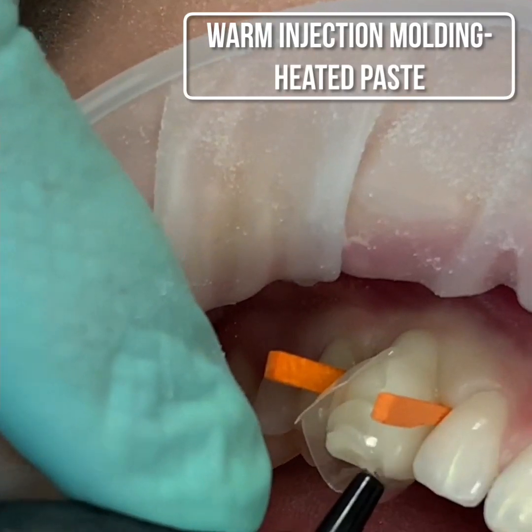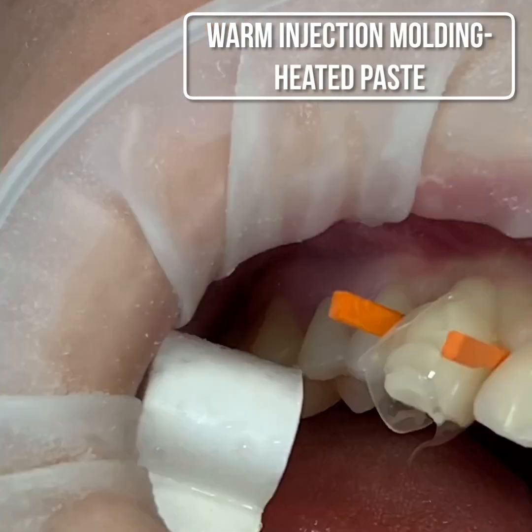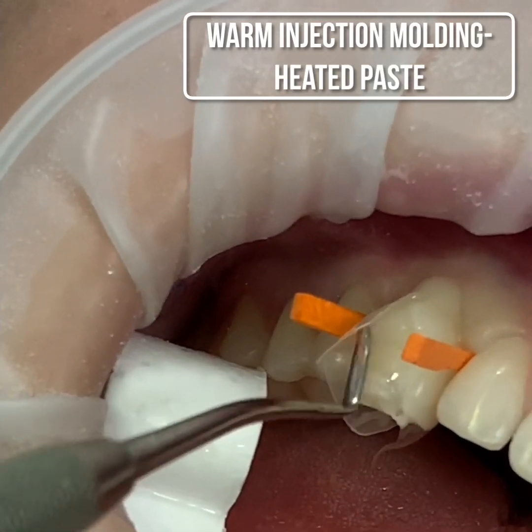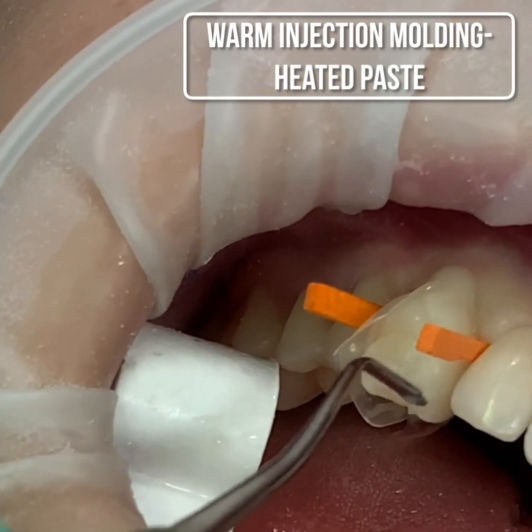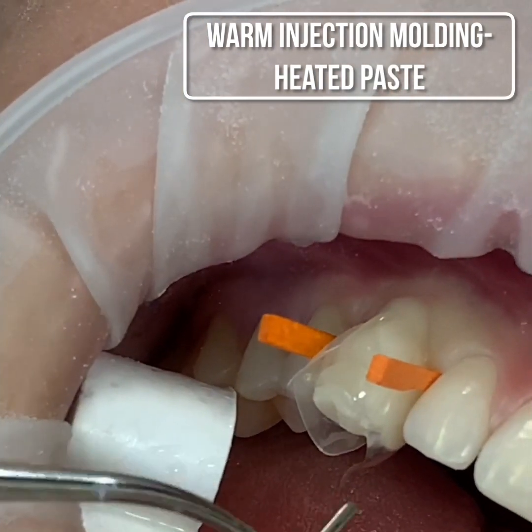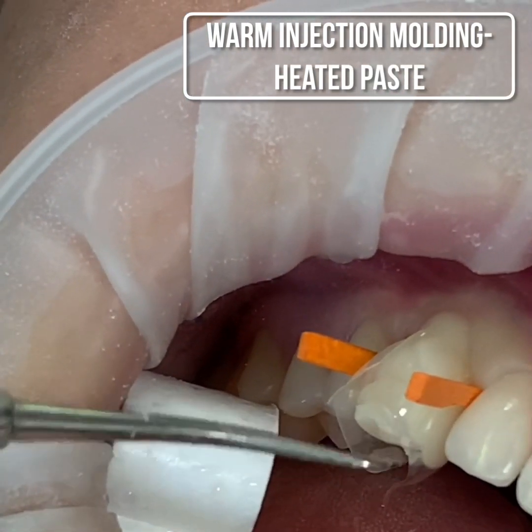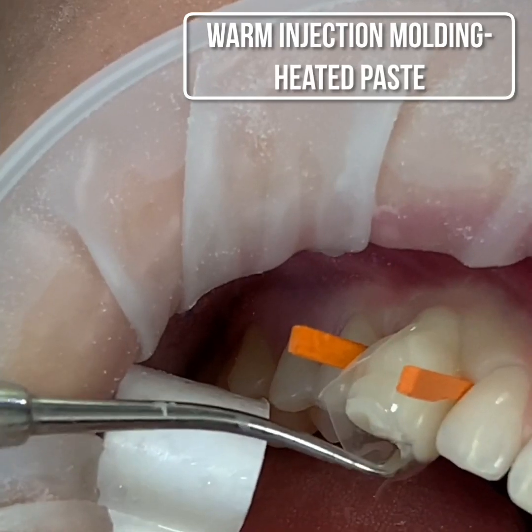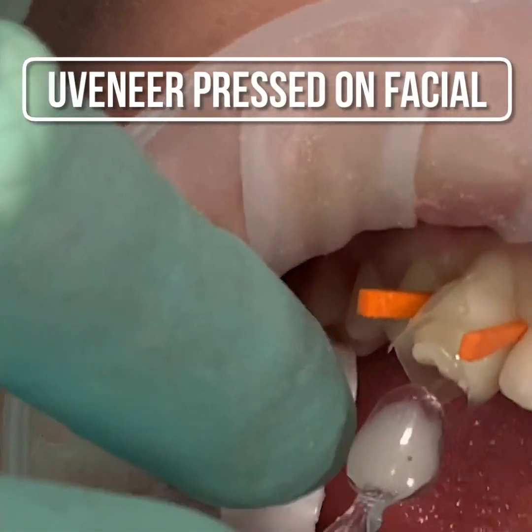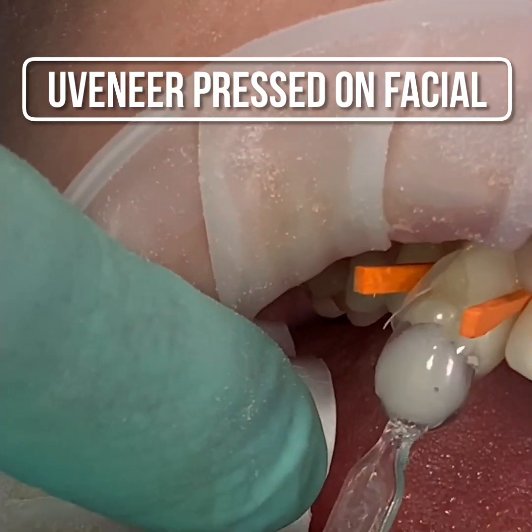So to help us get that shape, we will use the U-veneer to form the outside of the tooth and make it look more like a cuspid tooth. So here comes the form. We push it. It seals and fills all the areas so that there are no gaps.